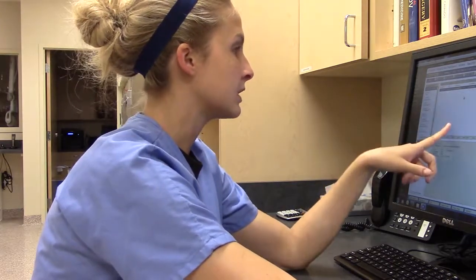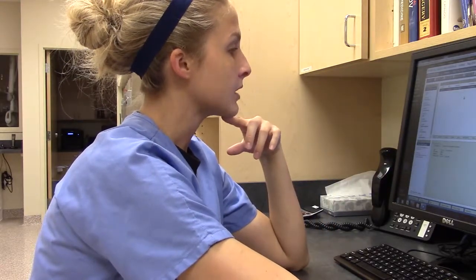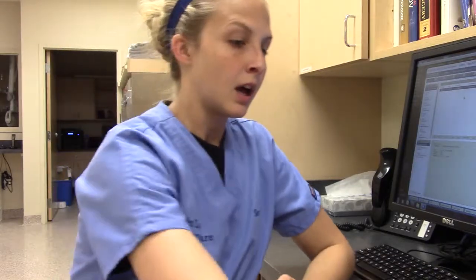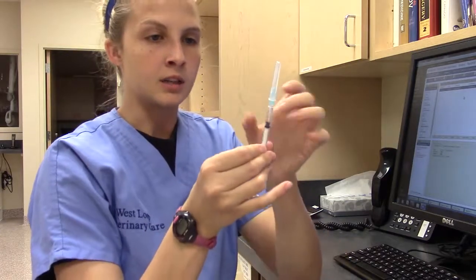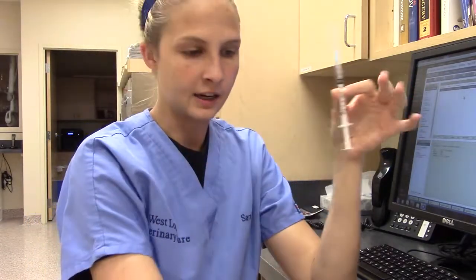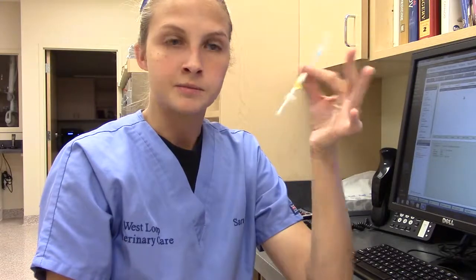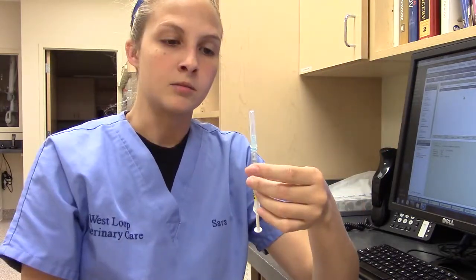Alright, so we've got Convenia here. It looks like we're going to be doing 0.3 mL, and that is going to be given sub-Q. We'll most likely do it intrascapular on our feline friend. We've got 0.3 pulled up here. You want to make sure all the air bubbles are out so you're giving the correct amount. I also have my label, so I'll go ahead and put that on there to confirm that it is Convenia and it's for Mr. Critters.